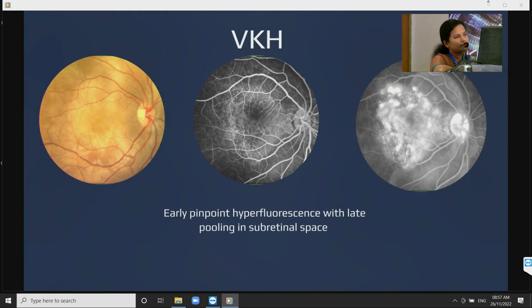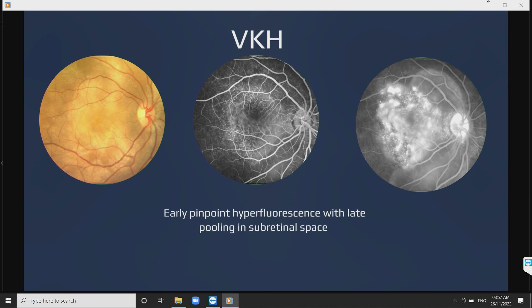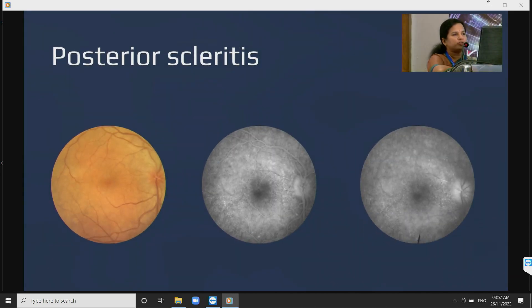In VKH, the typical FFA pattern is seen — pinpoint early hyperfluorescence with late pooling in the subretinal space. These typical patterns help in the diagnosis. In posterior scleritis also there will be pinpoint leaks with disc leakage, so FFA helps in differentiating some conditions.